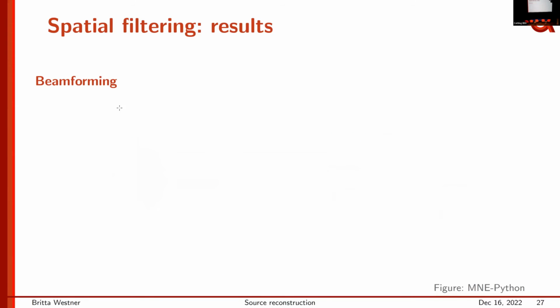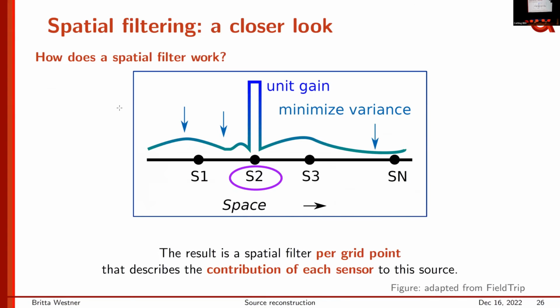We can, if we go back here, imagine if activity fits none of those source points, maybe because it was 50 hertz coming from across the room, it will not or only very minimally end up in source space because it just doesn't fit any of the filters of those source points.